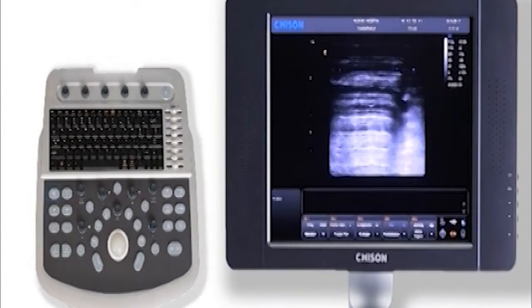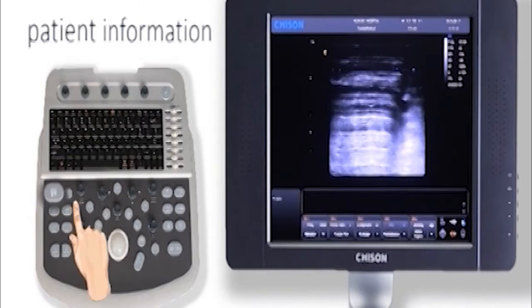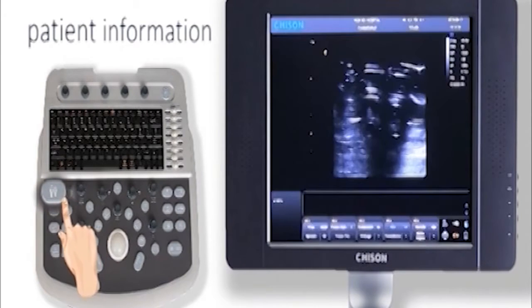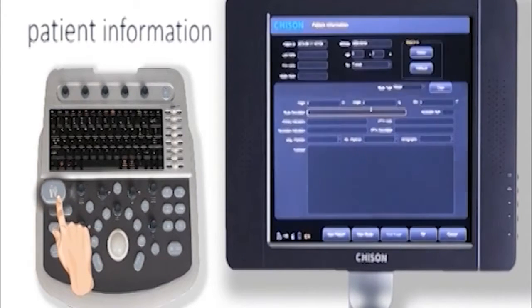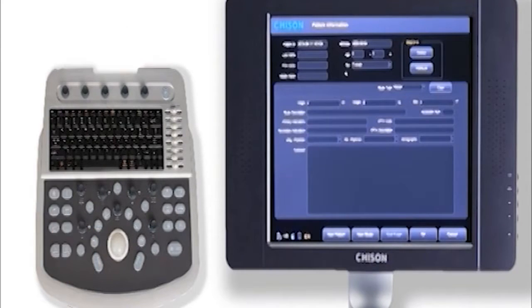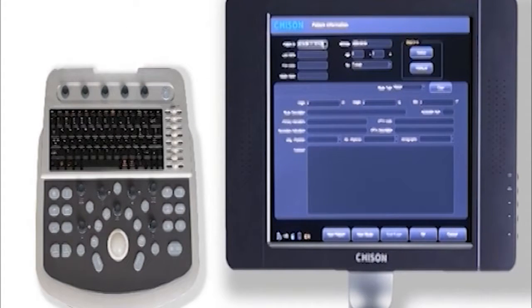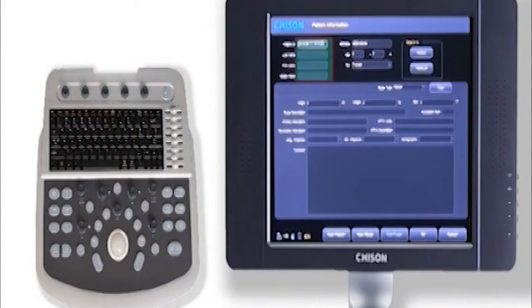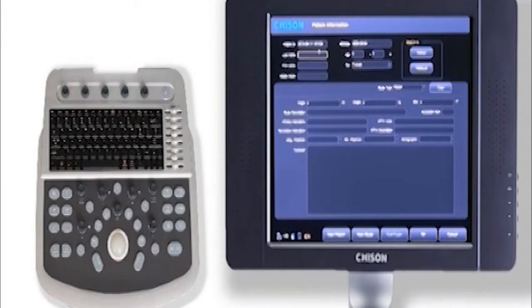To begin, push the patient button to get into the patient information screen. Now it automatically shows a patient ID. I need to input last name, first name, sex, and age.